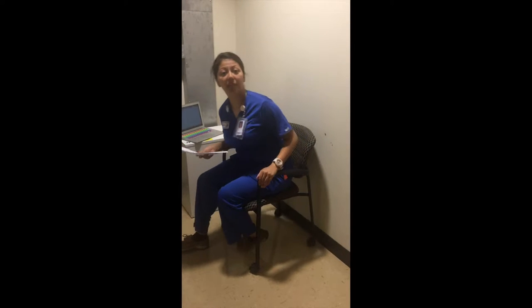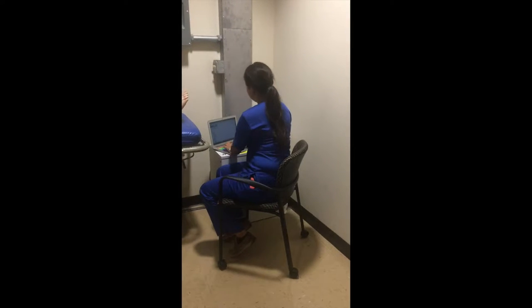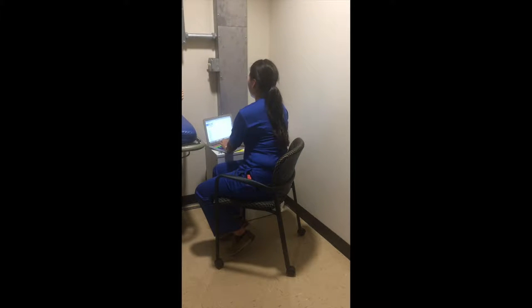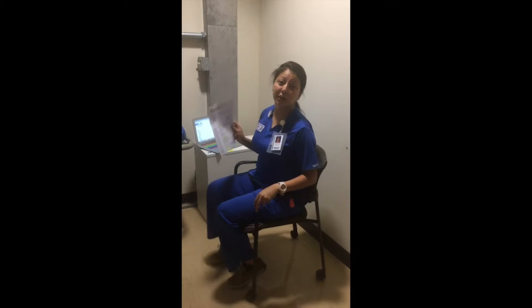So we just got a work order. I look at the patient's name, their date of birth, how old they are, and if they're male or female. This patient is 22, so I'm going to have to look up her labs and check if her pregnancy test came out negative before we do any radiation to her. They're negative, so now we're going to go pick her up from the emergency room and bring her to the room.